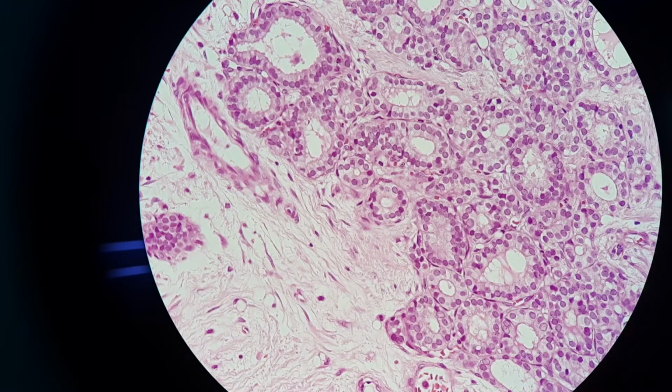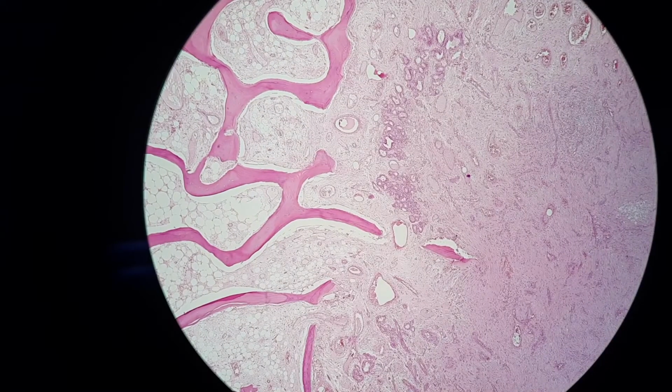Because this patient hasn't previously been diagnosed with thyroid carcinoma, what we need to do is some immunostains to help us identify where the primary site is.